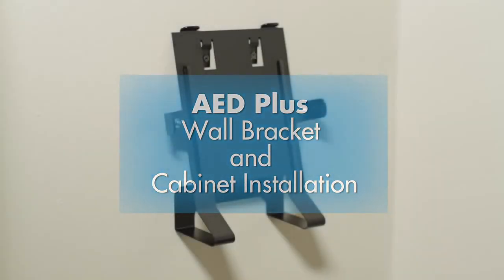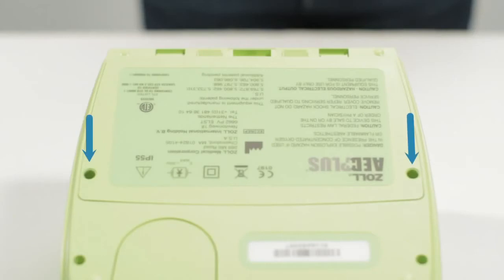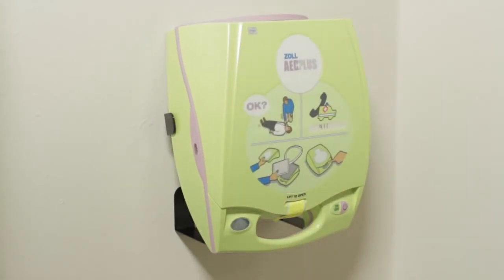If you keep your AED Plus on a wall using a mounting bracket, note the two round posts on the bracket and the two holes on the bottom of your AED. Line up these holes with the two posts. Push in the AED Plus until it snaps securely into place. Be sure to mount it with the handle down so the graphics on the lid will be right side up and readable to a potential rescuer.